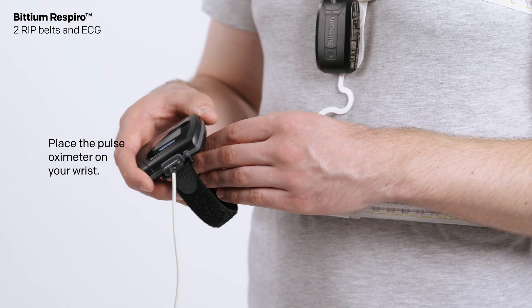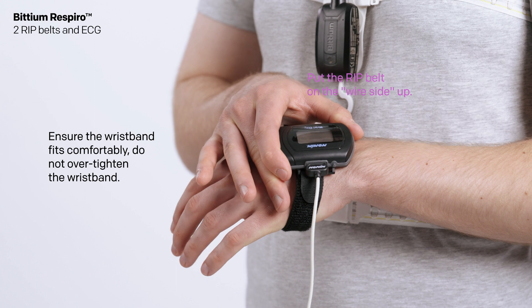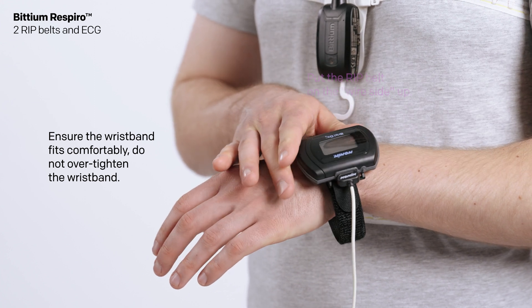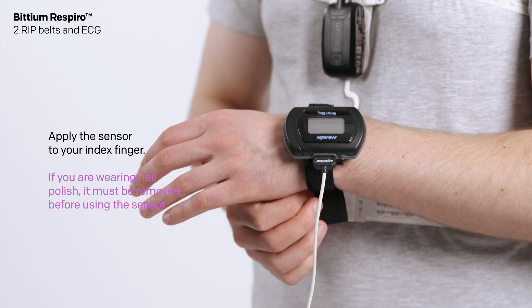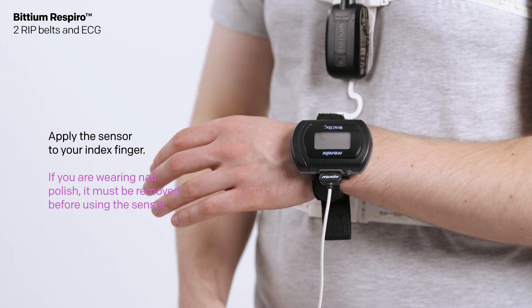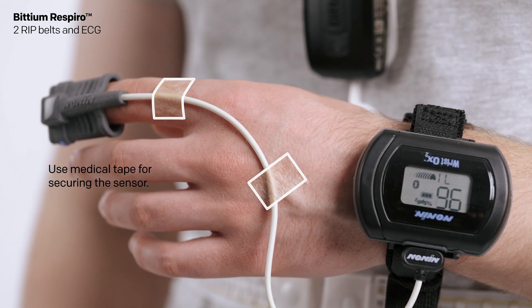Place the pulse oximeter on your wrist. Ensure the wristband fits comfortably — do not over-tighten the wristband. Apply the sensor to your index finger. If you are wearing nail polish, it must be removed before using the sensor. Use medical tape for securing the sensor.